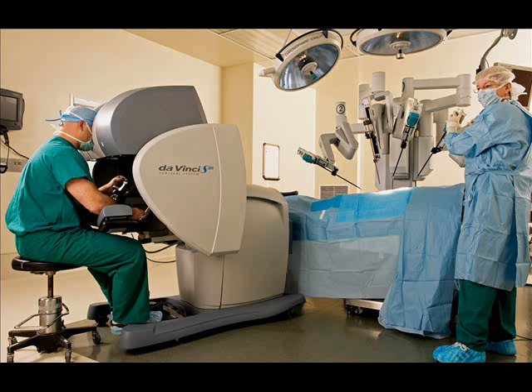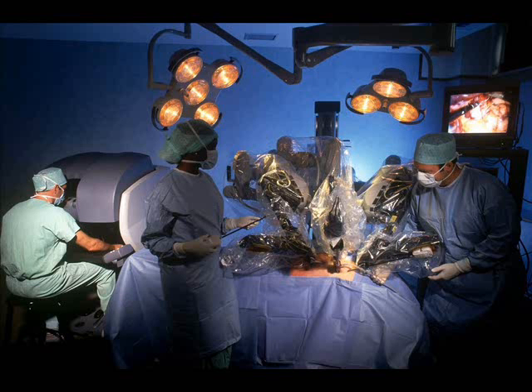The pelvic nerves are clearly visualized during robotic-assisted procedures. Less clear, however, is whether or not these supposedly improved optics and visualization improve patient outcomes with respect to postoperative impotence or incontinence, and whether long-term patient survival is improved by using the three-dimensional optics system.